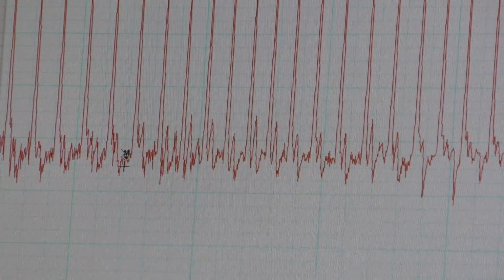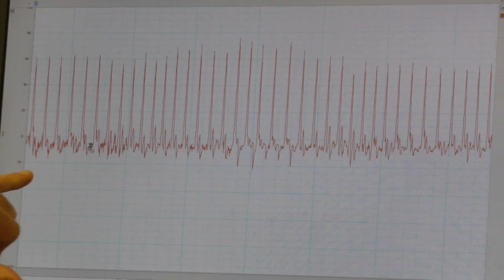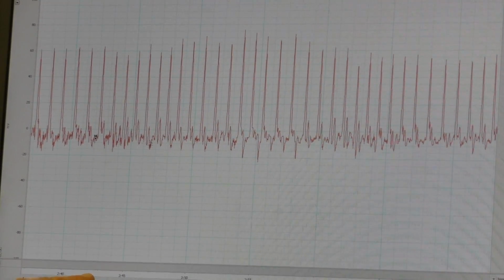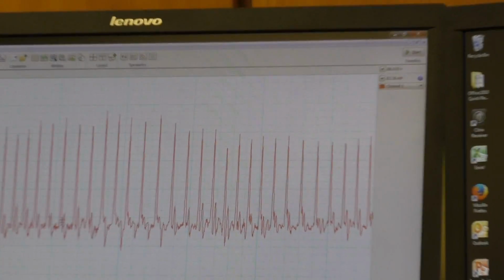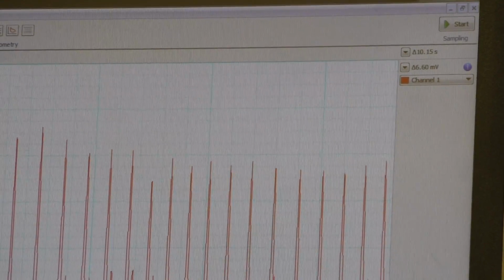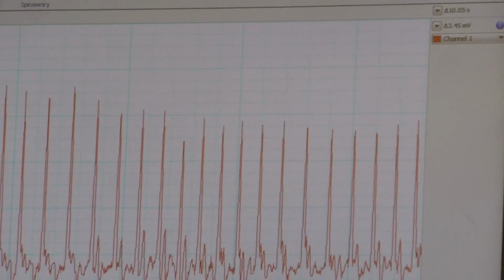For an analogy, if we were measuring your height, the initial point would be the floor, and the final point would be the top of your head. In this case, I've dropped the marker here, and the marker is sitting between 2 minutes and 40 seconds to 2 minutes 45 seconds. I'm just going to move across the screen, and what I can see here is that I get a delta and a measurement in seconds. So this is a delta time, and with this, I am going to go to 10.05 seconds, close enough for me. So I moved across the screen here.